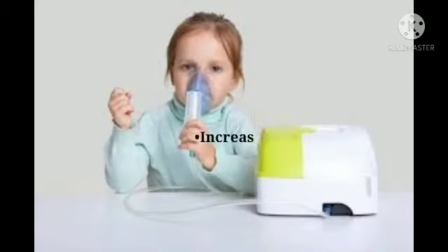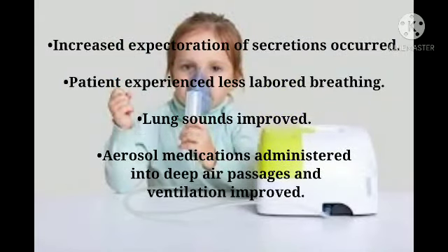Evaluation. Increased expectoration of secretions occurred. Patient experienced less labored breathing. Lung sounds improved. Aerosol medication administered into deep air passages and ventilation improved.